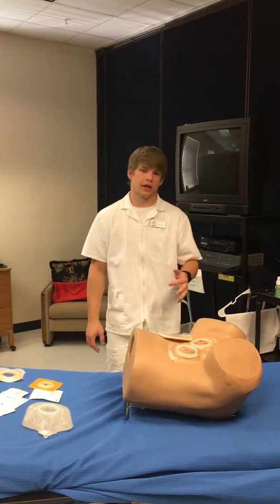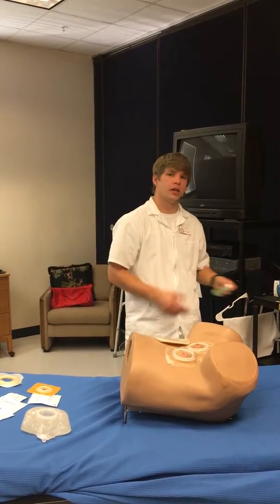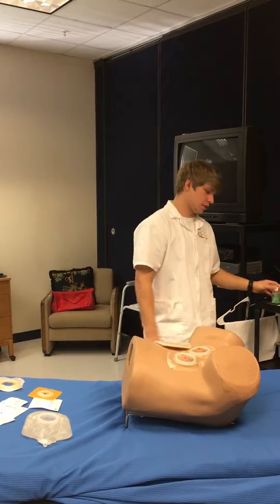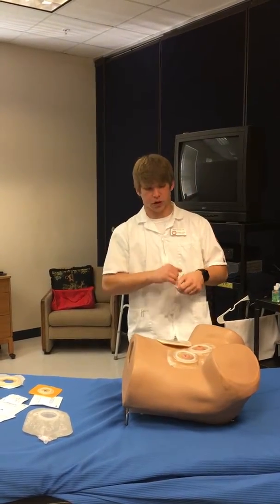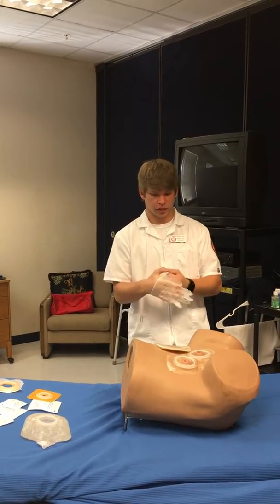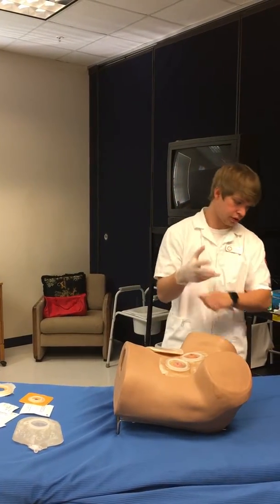Today we're going to be doing stoma care. First thing you want to do is come in, get some hand sanitizer, clean your hands, and don clean gloves. You want to identify your patient using two identifiers, checking their name and date of birth according to their armband.